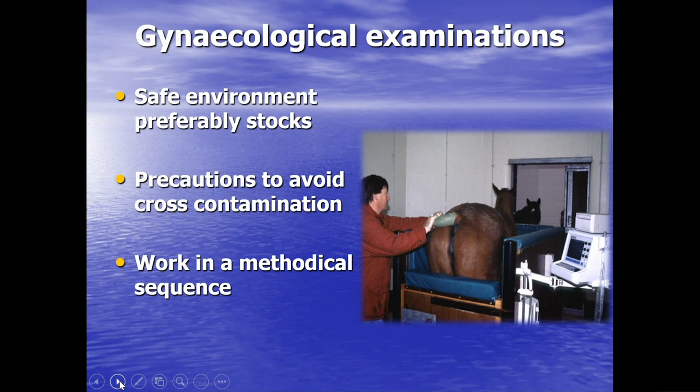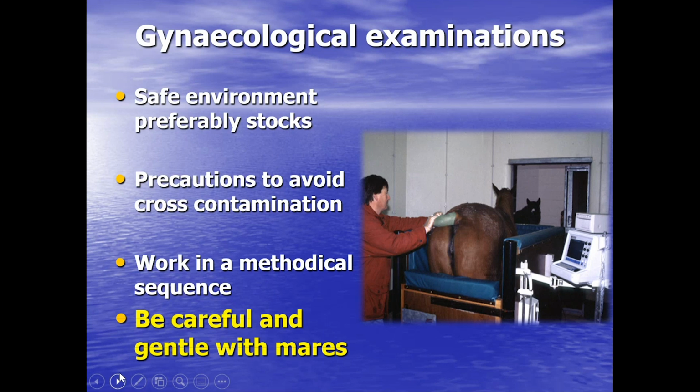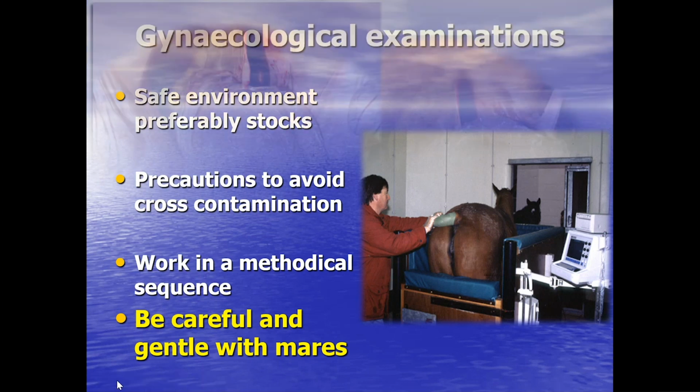And that's really important in equine reproduction in general, mare gynecology in particular. Work in a methodical sequence. And never forget to be careful and gentle with the mares. You are doing an invasive procedure and it is possible to damage the mare. So it's important at all times that we are careful and gentle with the mares that we're working with.